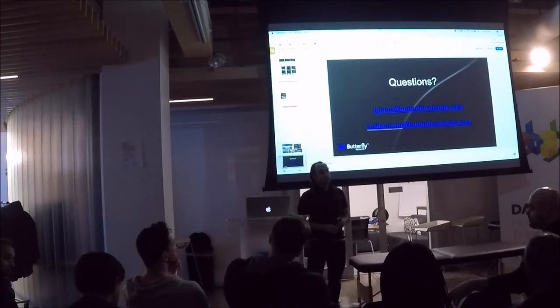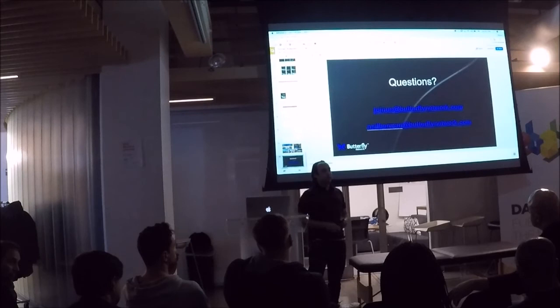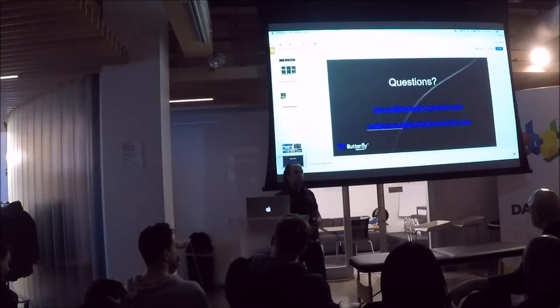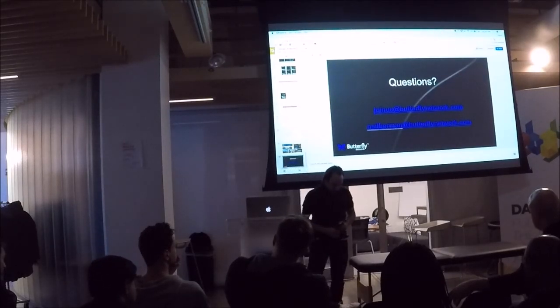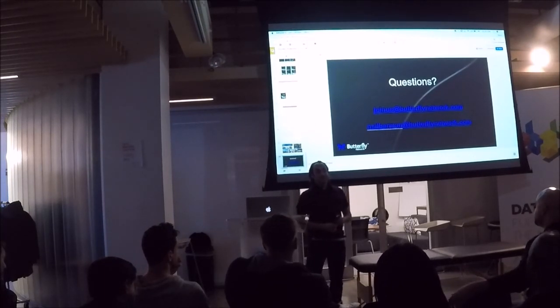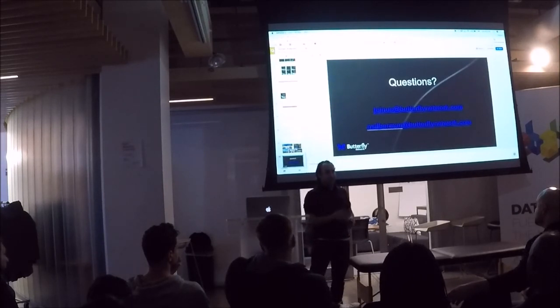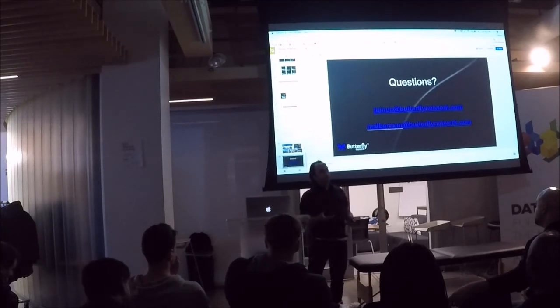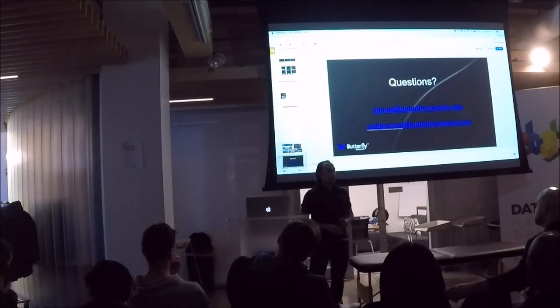Have you found that technicians have differing opinions of the same image from your device? You mean can they tell the difference, or do you mean like? Like if they're looking at a GE image, they're like, okay, this is what I think, this is the measurement. But then when they look at raw images from your device, they're like, actually, I think it's this, and someone else thinks it looks like something else. We haven't done a side-by-side comparison of annotation. There is certainly side-by-side that's done when it comes to getting a device like this cleared. So comparisons of image quality are hugely important, not just for FDA clearance, but also for ensuring that there's real value.